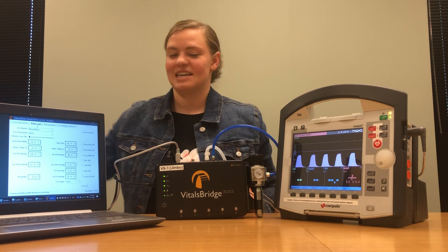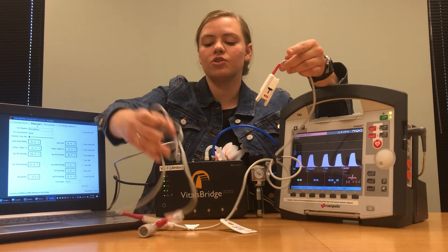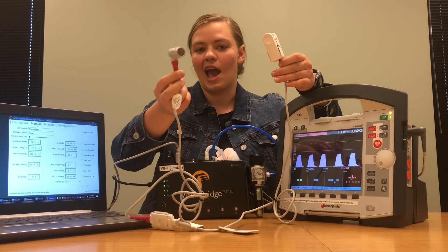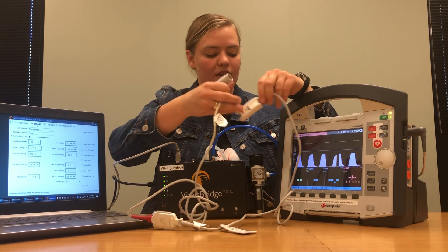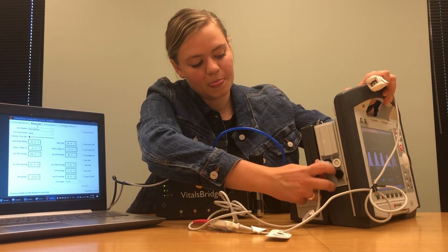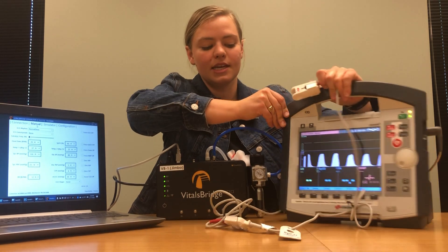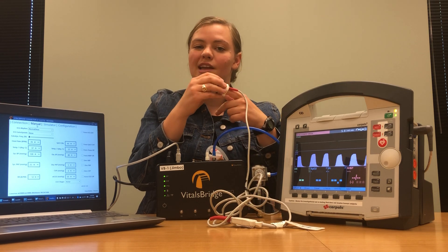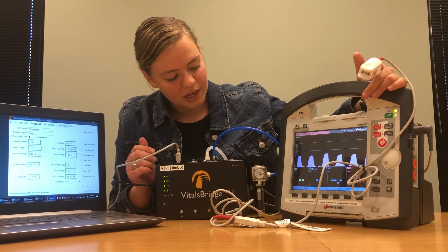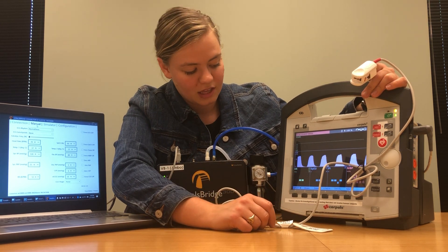Let's start the next connection — we're going to connect SPO2. The SPO2 cable for your patient monitor has a probe on one end and a connector for your monitor on the other. Plug it into your patient monitor right where it says oximetry. Once you have that plugged in, I like to put it on my own finger and test to make sure that your SPO2 probe is actually working.